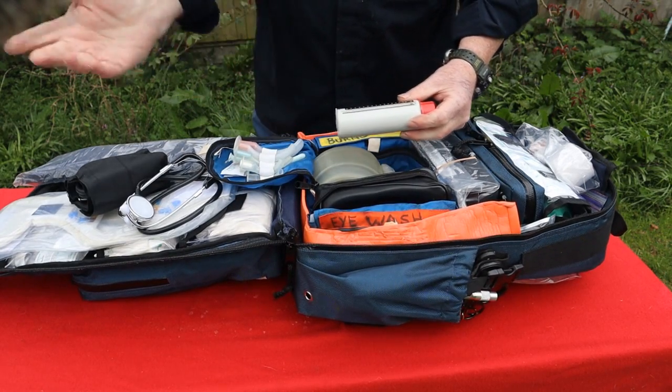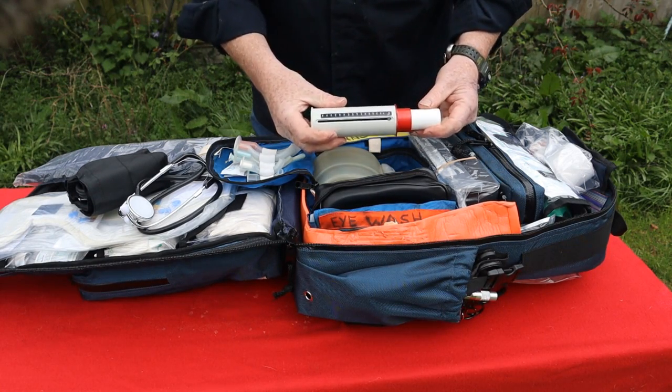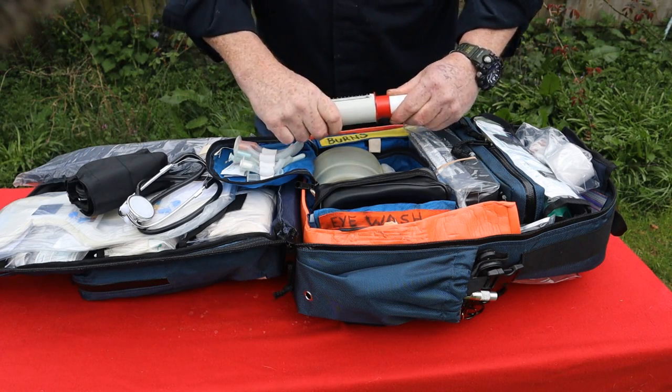Peak flow meter, so anyone with asthma, COPD, they would have had peak flow done fairly regularly, and it just measures the capacity of the lungs.